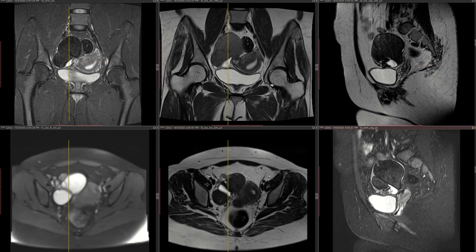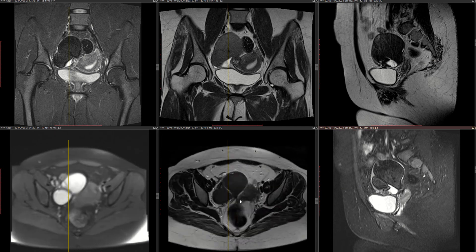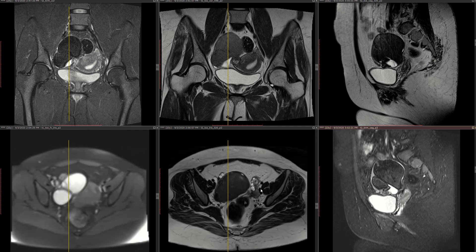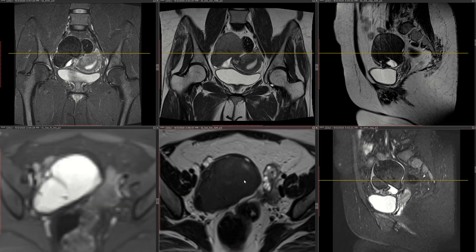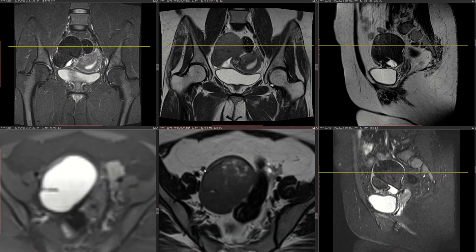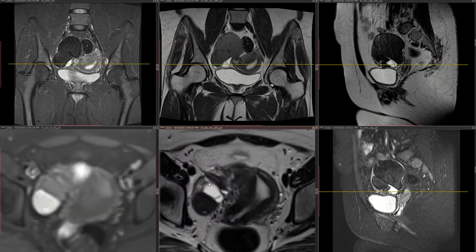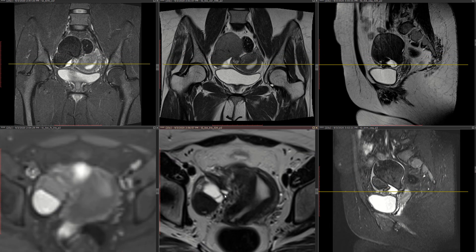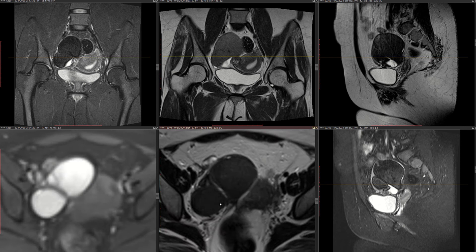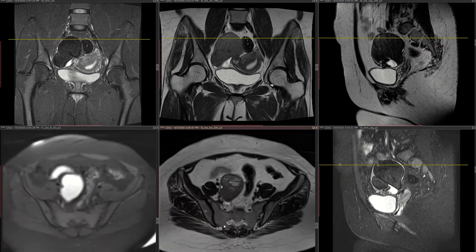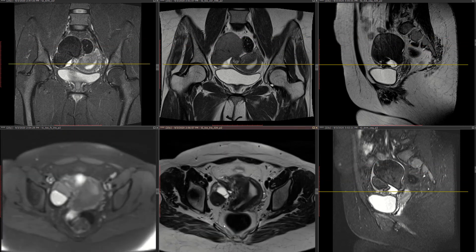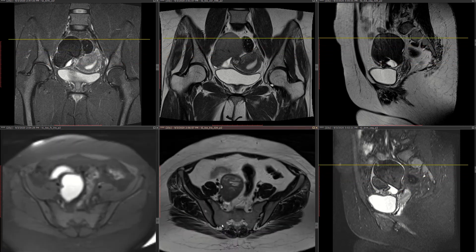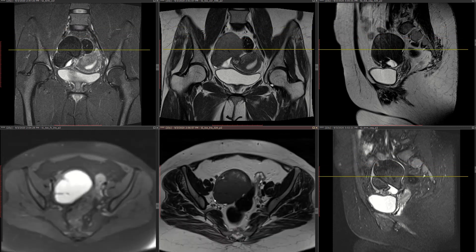The other differential for this hyperintense part is that it could be a follicle — an ovarian follicle. For example, you can see the normal left ovary on this side, but on the right side you don't really see the ovary, though there are some follicles here. So this may be part of a follicle, or it could be a decidual reaction within the endometrioma, which is actually a differential for more malignant pathologies.